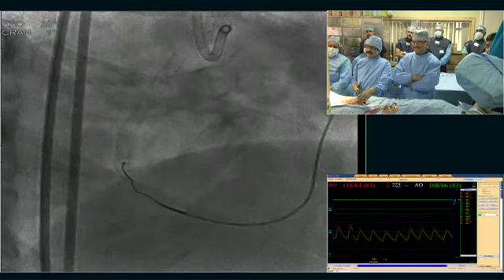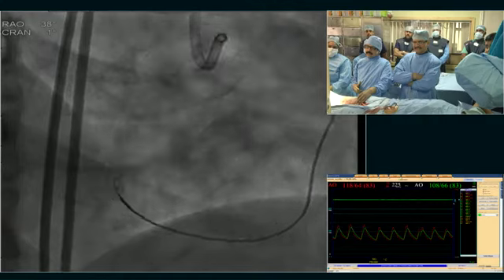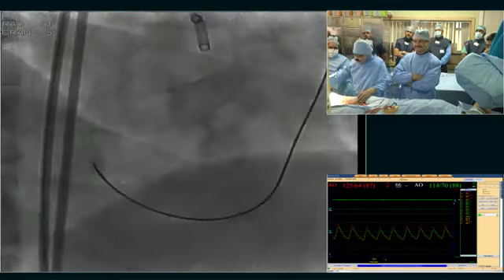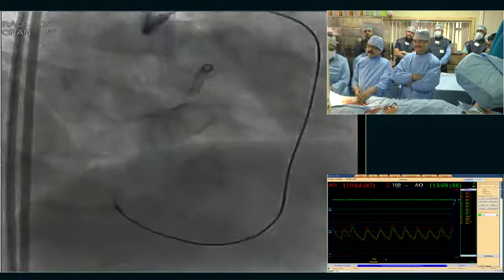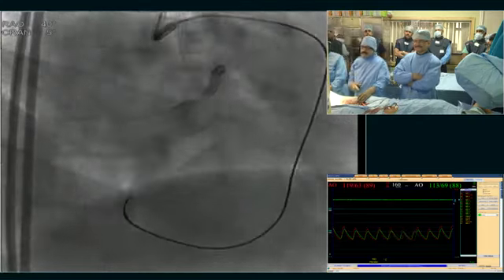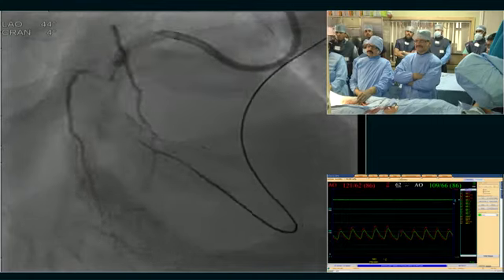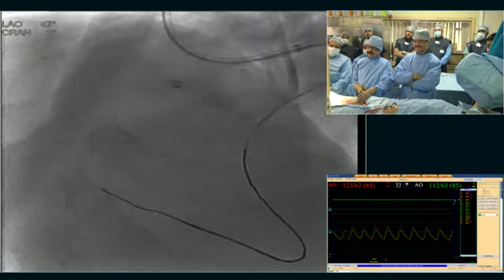Then the wires are going up inside the stent. We checked in RAO view and LAO view mostly, and once I find the lateral view also very good in RCA CTOs. Here we preferred all 3 views. But Corsair negotiation is impossible even with good backup of the EBU catheter. It is very tough tissue, and I could not enter the tissue. We struggled quite a lot for 1 hour, not able to cross the very hard tissue.